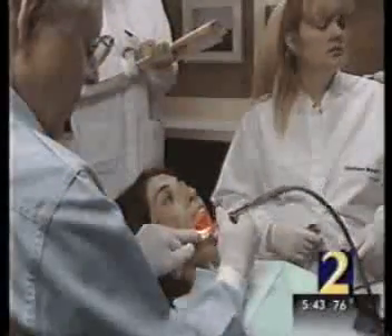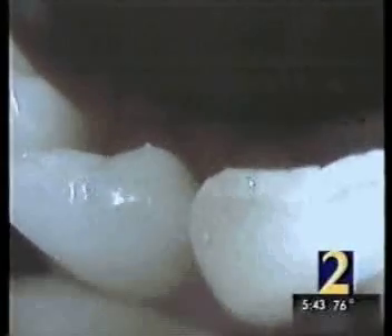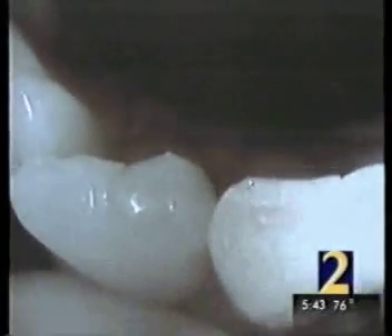Natasha Lajel had no idea she had such fractures. Usually you don't understand what they're really saying — you just say okay, I got this and this. I like them to see the monitor as I see it, and we discover together what that is.